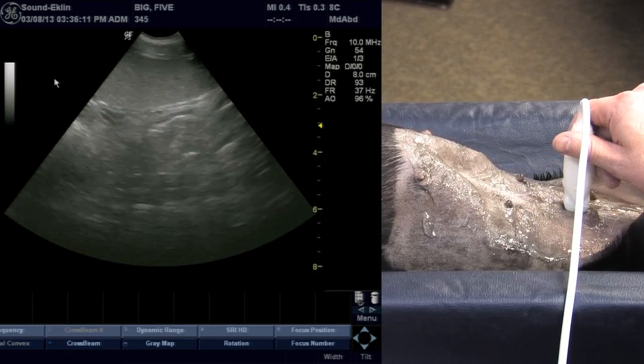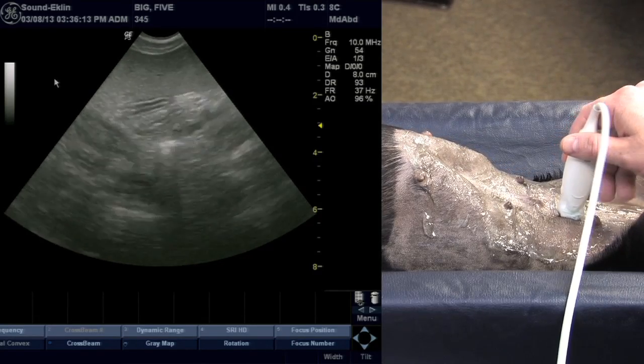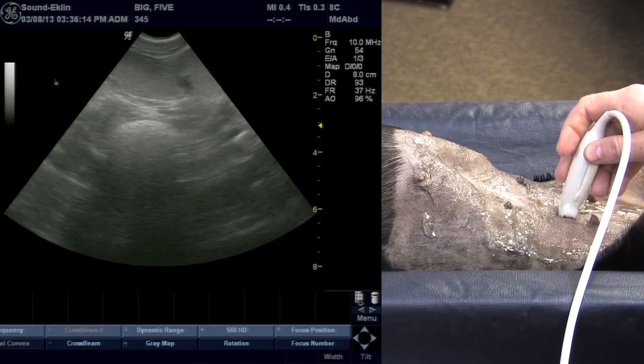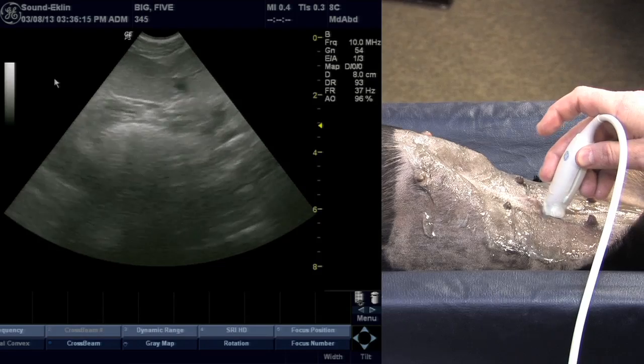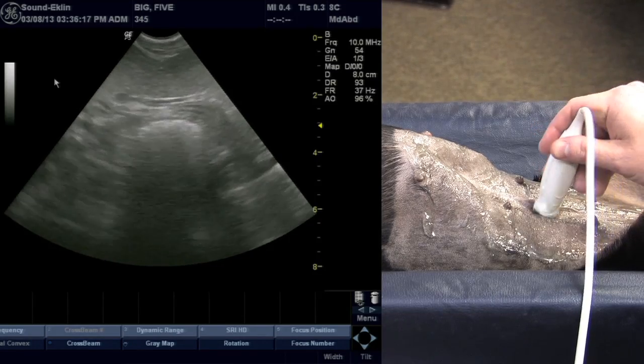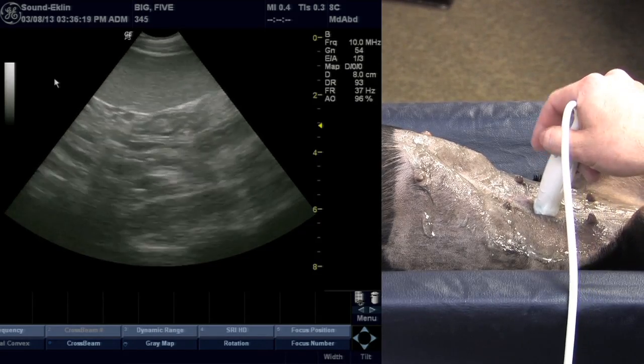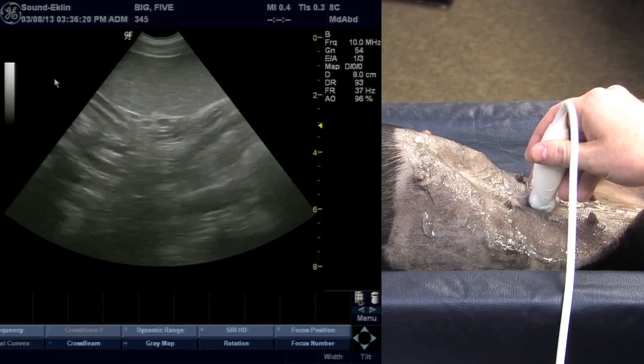If I encounter a lesion or an area of interest within that spleen, I will typically evaluate it in orthogonal planes, meaning I will turn that probe 90 degrees to where the lesion is at.